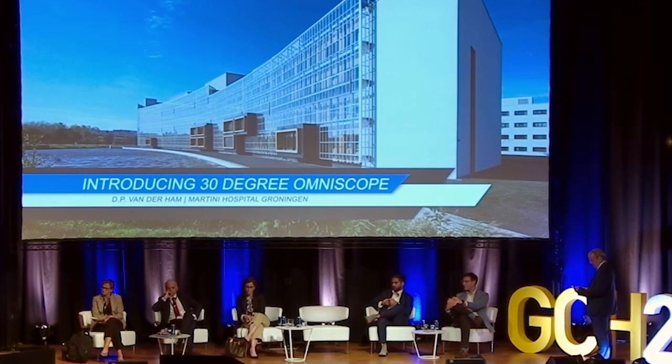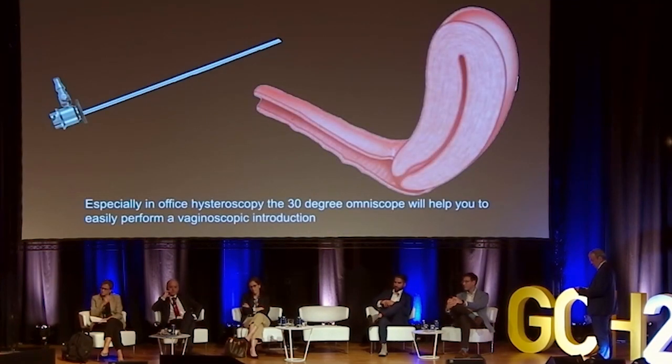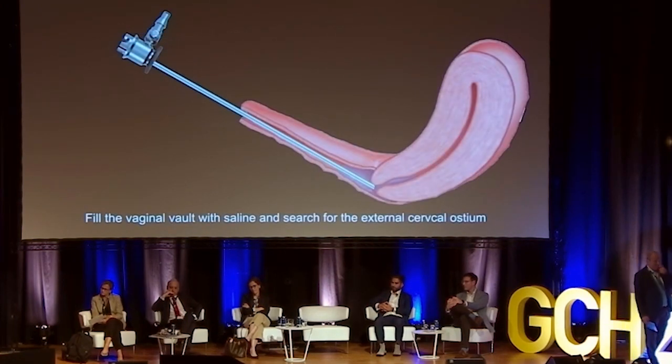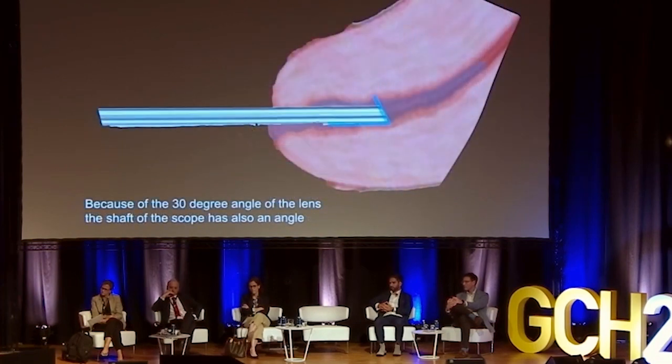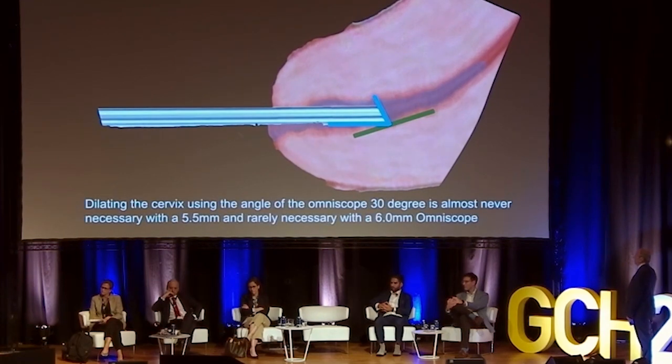Now a short animation on why I think a 30-degree or any angled hysteroscope will make it easier for you in an office setting to go into the vagina. And especially here, you just use the scope guiding you through the vagina, and also when you have the working channel, it's an oval channel, so you can also twist it a little bit to get the right direction.